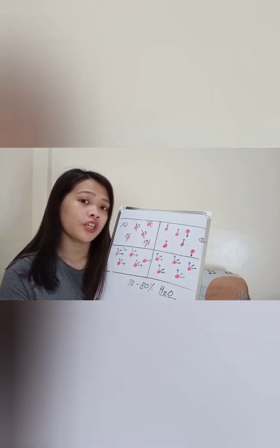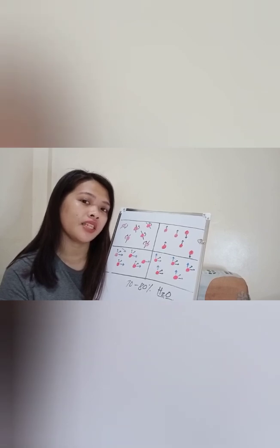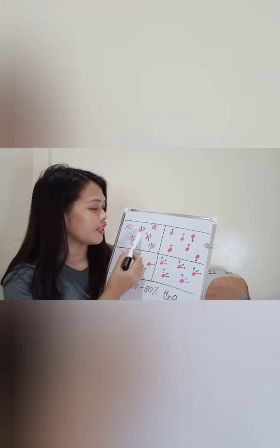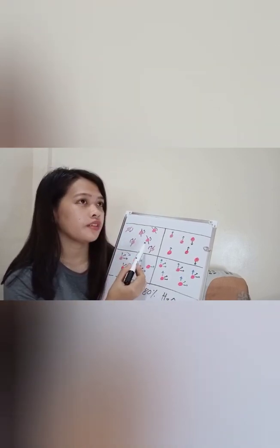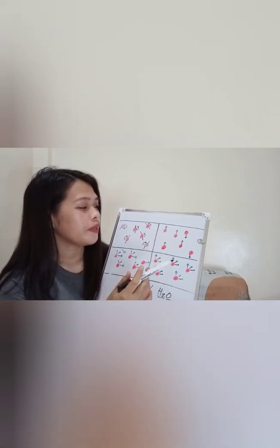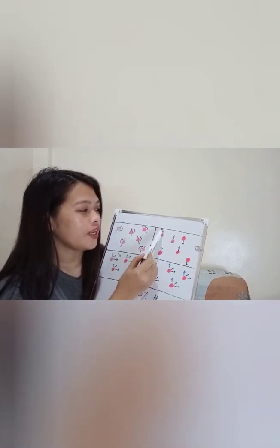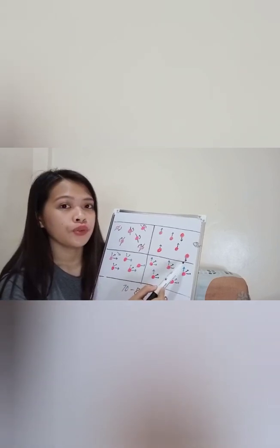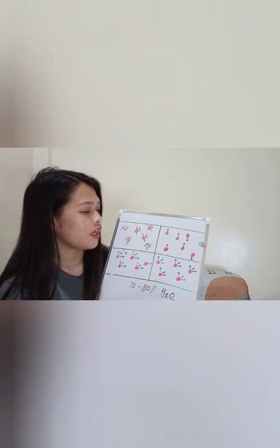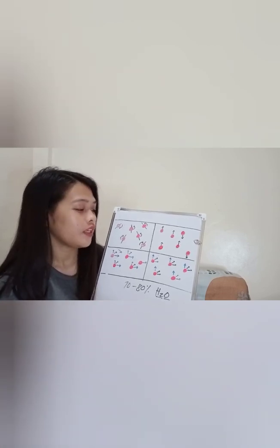As a spinning charged particle, it produces a magnetic field called the magnetic moment. Normally, the protons are oriented randomly, so there's no overall magnetic field. When the patient is placed inside the scanner, hydrogen atoms align parallel or anti-parallel to the primary magnetic field. This is called the longitudinal magnetization, along the long axis of the magnetic field.